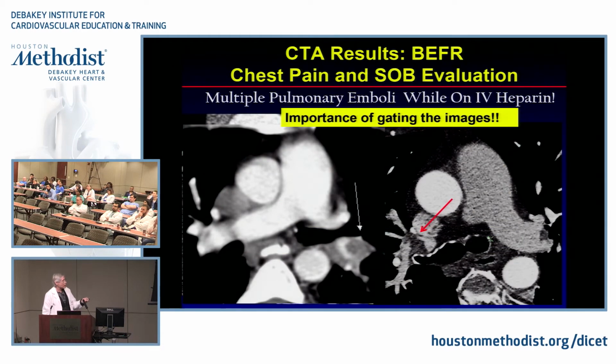This is a non-gated study. This is a non-gated CT, okay, which is what radiology does all the time, okay? And although you may pick up large pulmonary emboli if they're very proximal, believe me, when you look at these images, because of the blurring and motion artifacts, you can miss a lot of things.